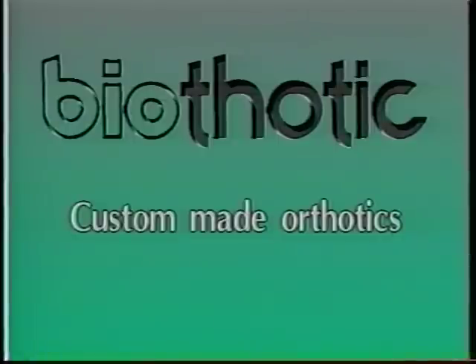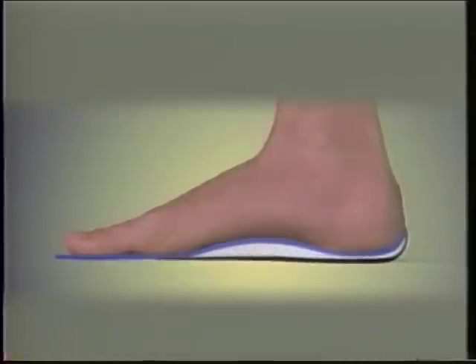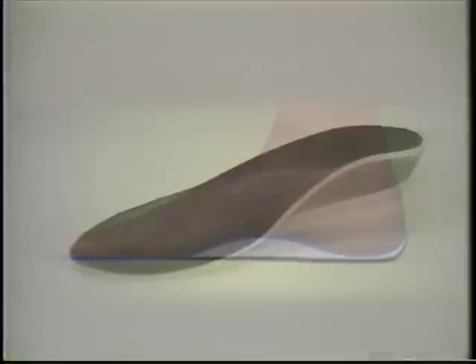OrthoFeet Incorporated is proud to introduce the BioThotic, the revolutionary custom-made orthotic that instantly molds directly to the foot.